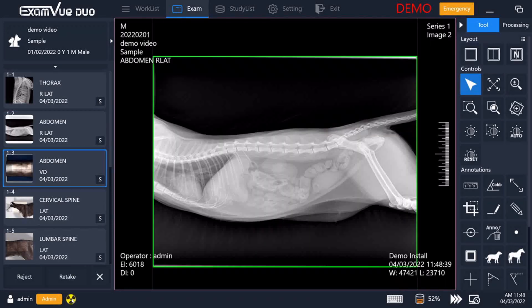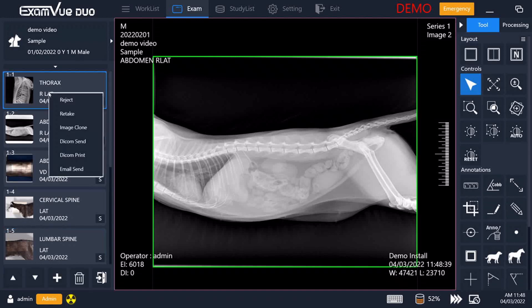You can at any time also go back and retake an earlier X-ray just by right clicking on the thumbnail on the left, and it will let you select to reject, retake it, and other options for it.